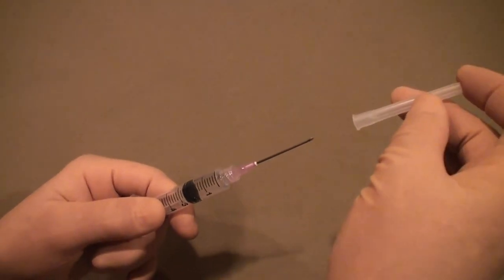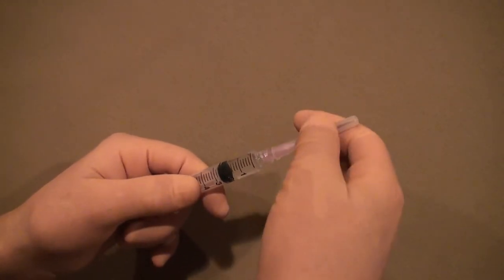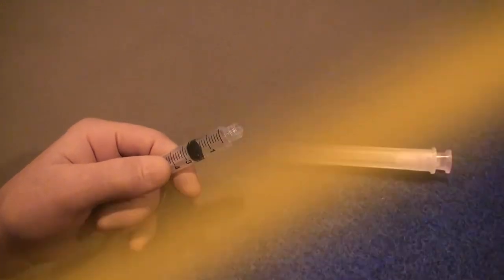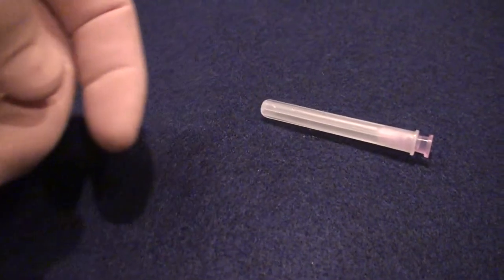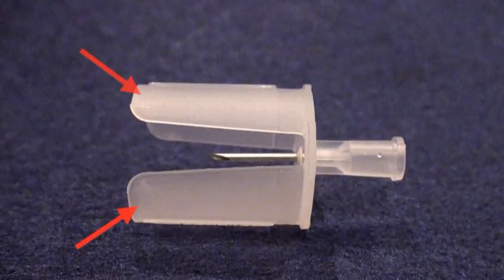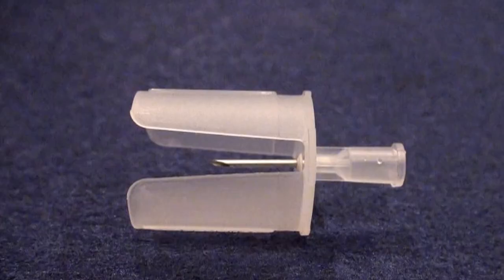MedMate's unique design, unlike that of a standard needle, eliminates the need for a cap, thus rendering recapping a thing of the past. The cap of a standard needle acts as a wrench, allowing for easy removal of the needle from the syringe. The cap also keeps the needle clean and protects from a needle stick. MedMate's patented needle guards protect from a needle stick without the need for a cap. MedMate's floating needle design protects the needle from contaminants, thus rendering the cap obsolete.